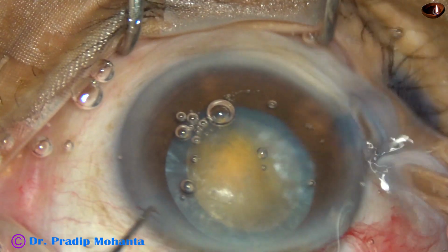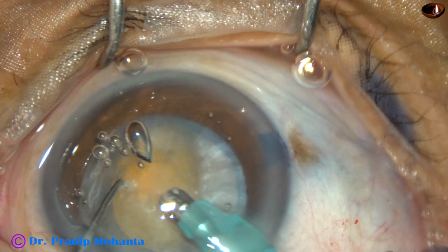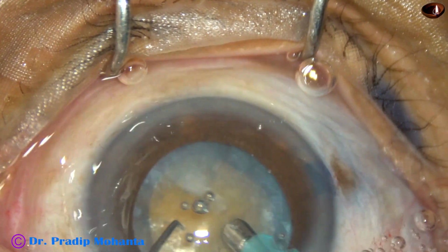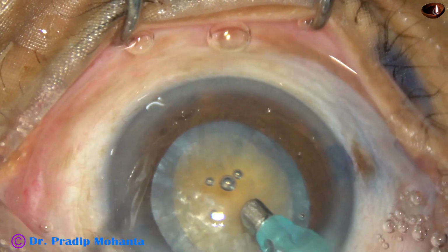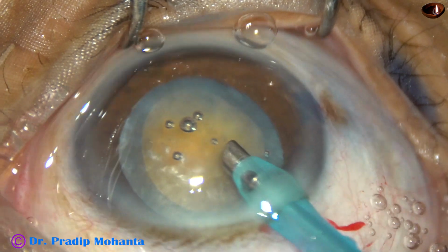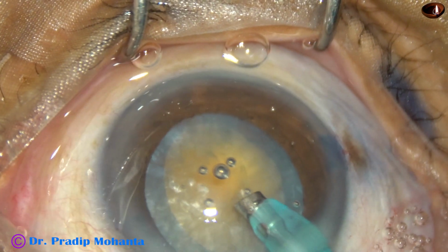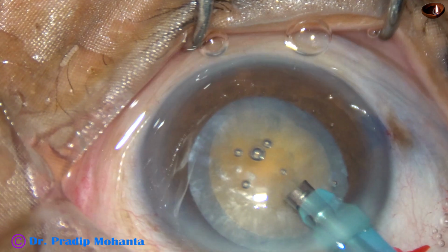Posterior capsular rent occurs even in the hands of experts. Sometimes we forget to take necessary precautions, and sometimes, in spite of taking all precautions, posterior capsular rent occurs. In this case, I could have taken some precautions, but I forgot to take those, and PC rent occurred. Let us see what happened.